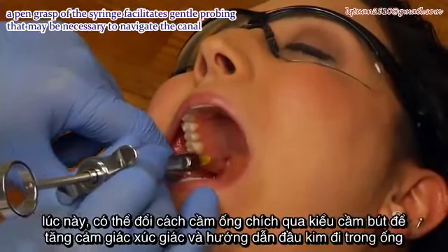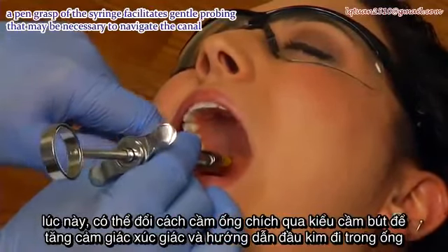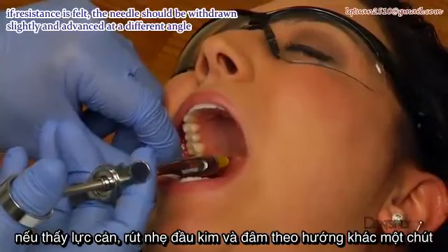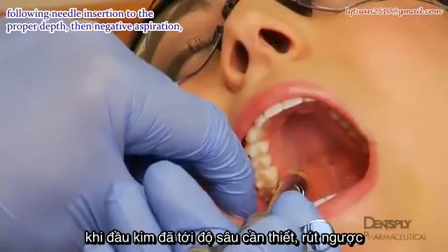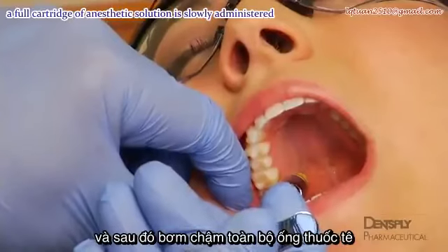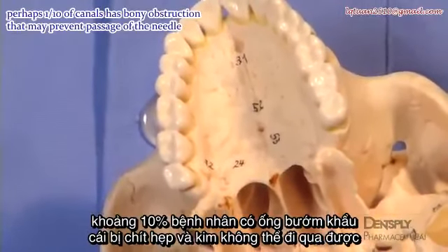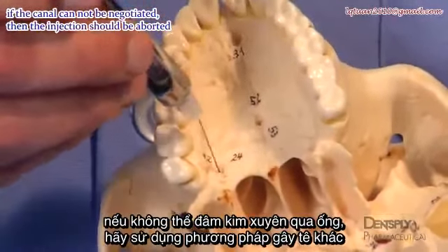A pen grasp of the syringe facilitates the gentle probing that may be necessary to navigate the canal. The needle is never forced. If resistance is felt, the needle should be withdrawn slightly and advanced at a different angle. Following needle insertion to the proper depth and negative aspiration, a full cartridge of anesthetic solution is slowly administered. Perhaps 1/10 of canals have bony obstructions that may prevent passage of the needle. If the canal cannot be negotiated, then the injection should be aborted.